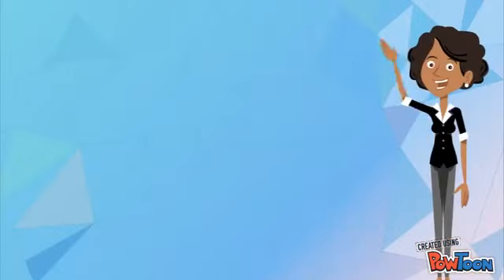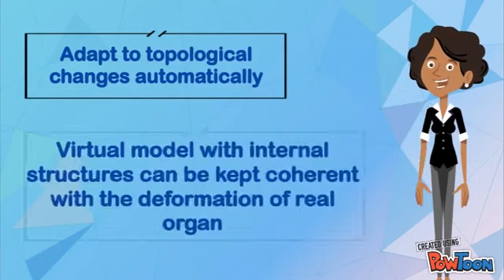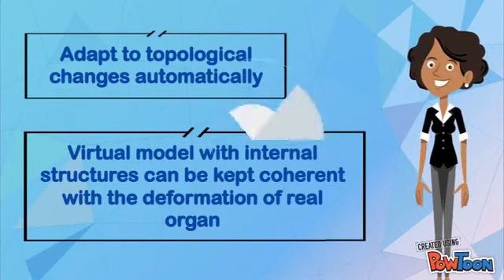This application can adapt automatically to topological changes detected in the intraoperative model. Besides, the virtual model with internal structures can be kept coherent with the deformation of the real organ after an incision.